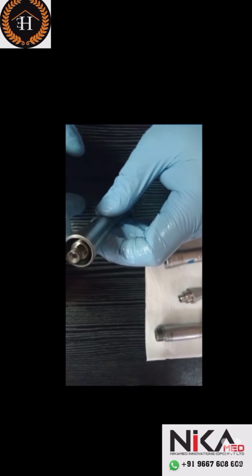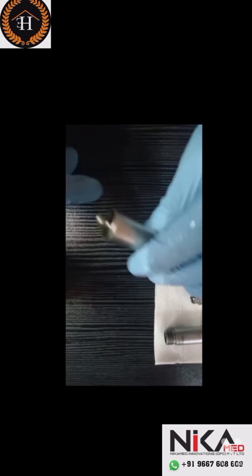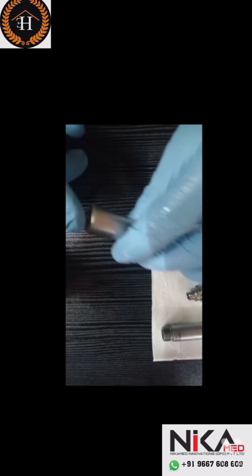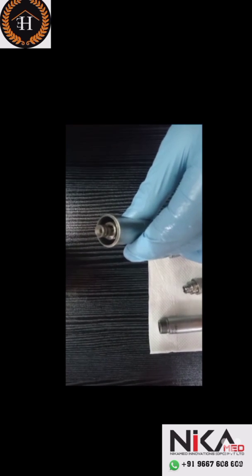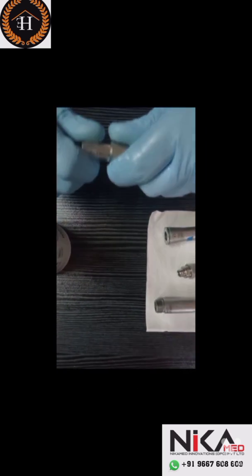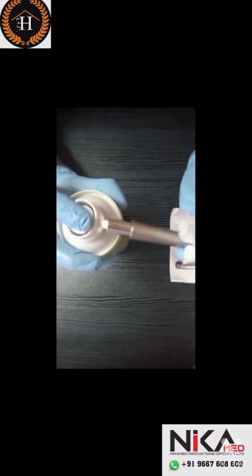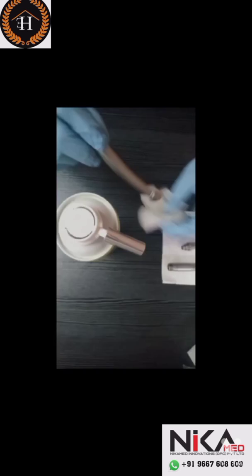This is an NSK X-Maxx handpiece with LED coupling. Many doctors are lubricating it using the pointed nozzle, which is not good as it can damage the LED portion. Use this kind of specialized nozzle instead — insert the handpiece into this portion and spray the oil for 2 seconds with full pressure. You can then clear the excess oil.